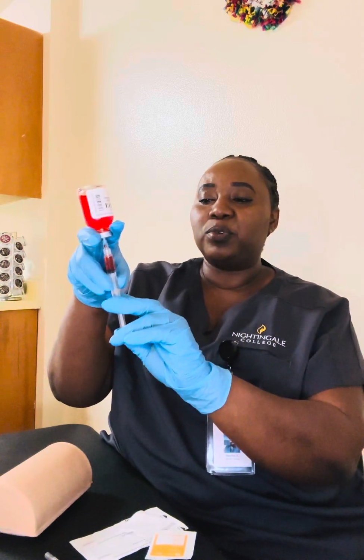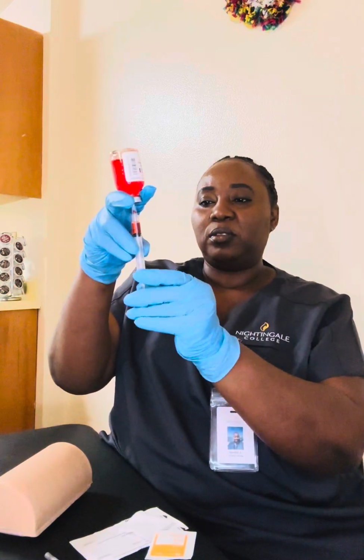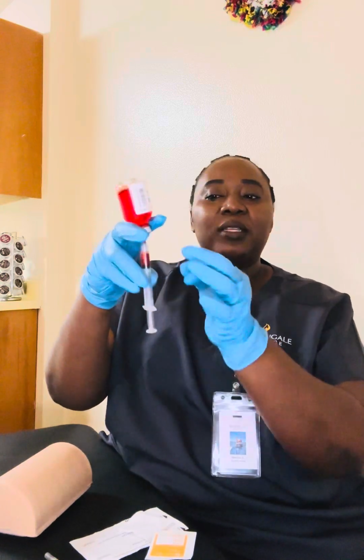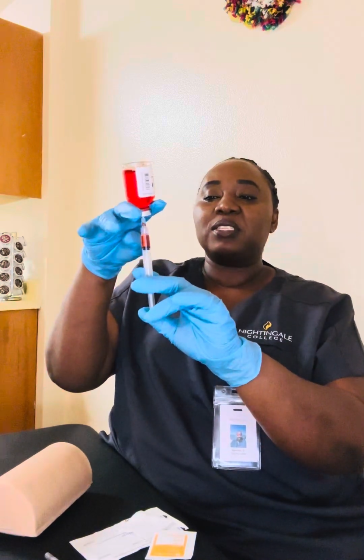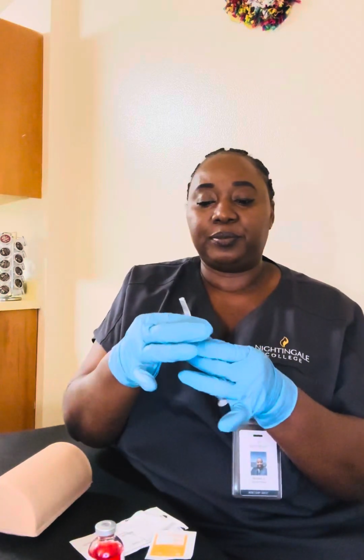So if there are bubbles at this point, I'm going to tap. If there is more that I want to push up, I can flip. Once I've established it is 1 ml, I'll gently remove the vial, place it down. And if the patient is not with me, I'm going to cap, do the 1 hand cap. This is 1 ml.